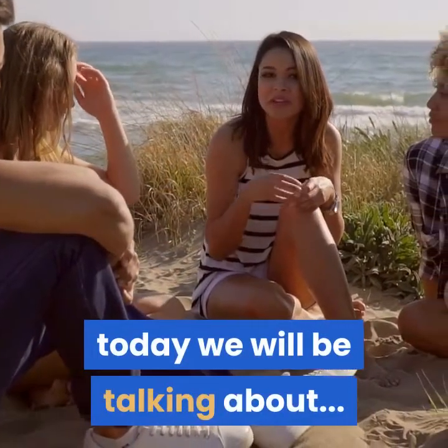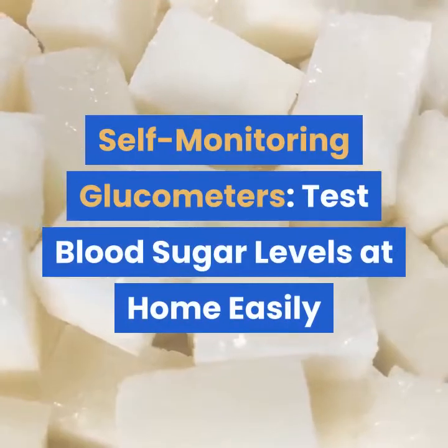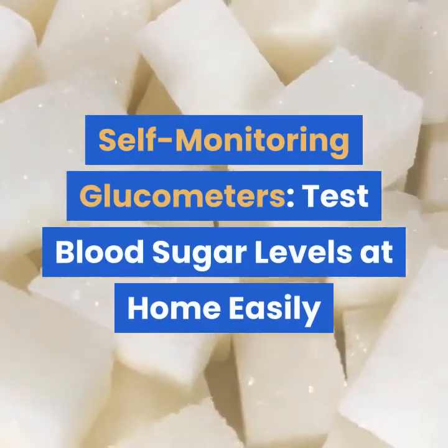Today we will be talking about self-monitoring glucometers and how to test blood sugar levels at home easily.